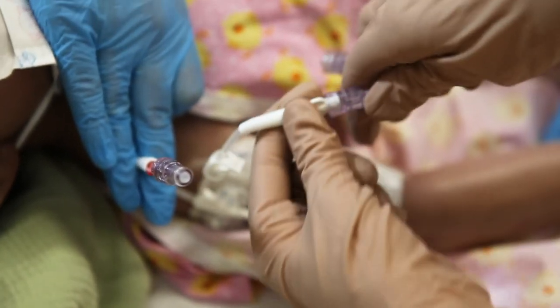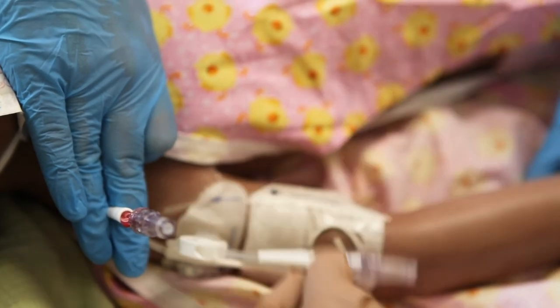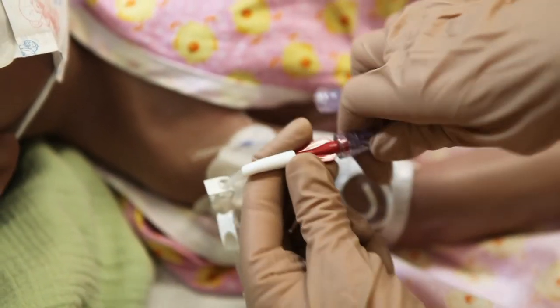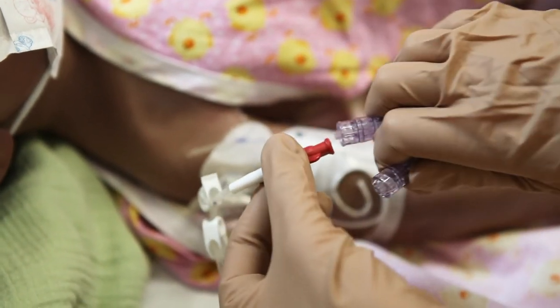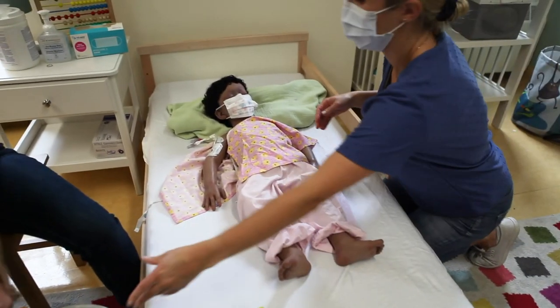Ensure the cap is on tightly. Be careful not to touch anything else. Throw the old cap in the garbage. Repeat the same step on the second lumen if your child has one.